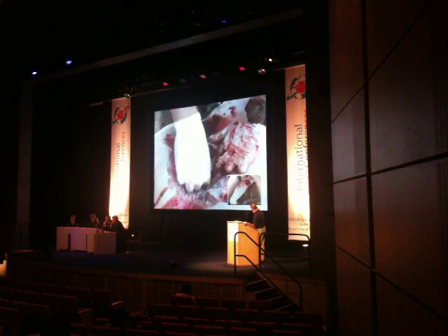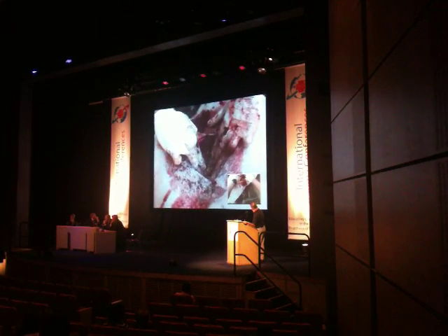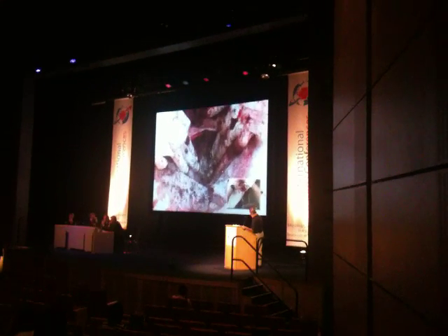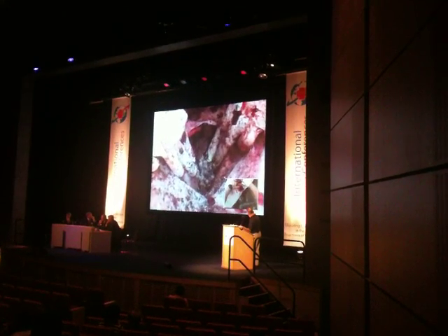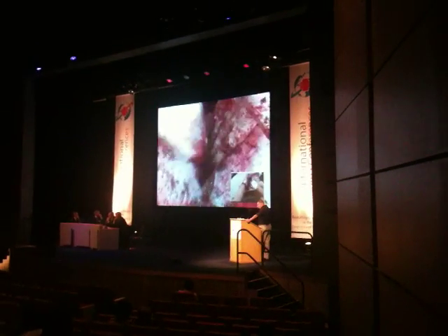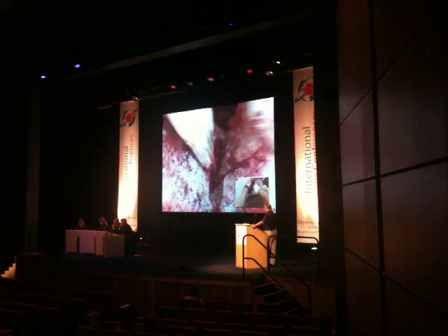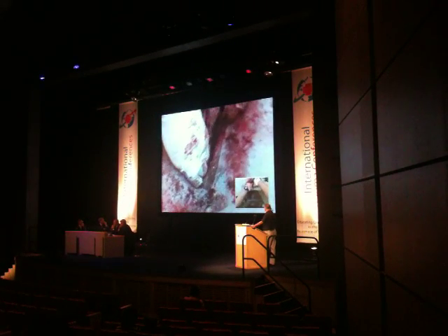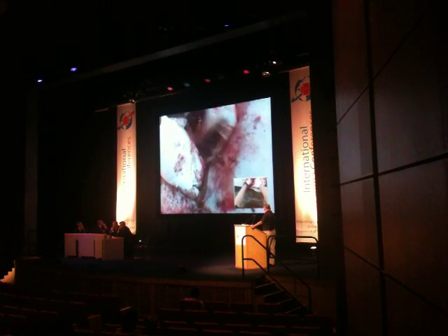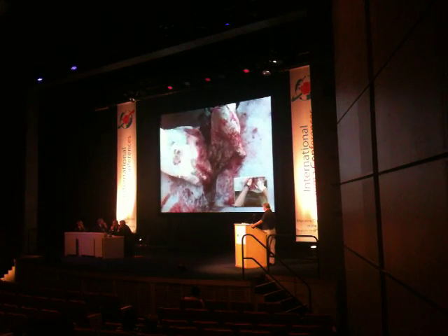Now he's going to check the bleed. You'll notice there's sufficient pressure to push the agent up and it begins leaking right there. Mixing the blood back with the agent, the instructor continues to knead and force the product down to the bottom of the wound bowl. He starts picking the agent up from other areas within the wound bowl where it is not kneaded and not doing its best work, and he moves the agent around.